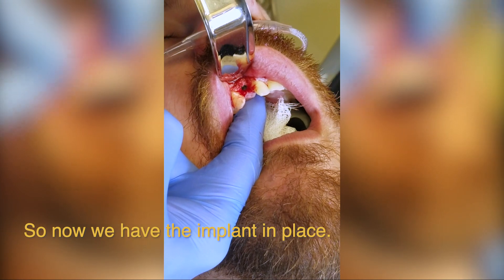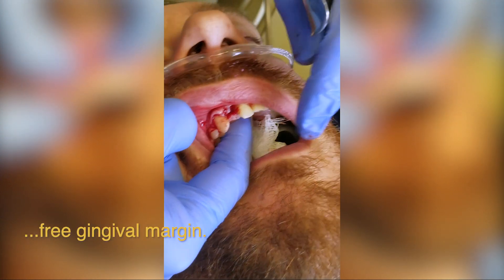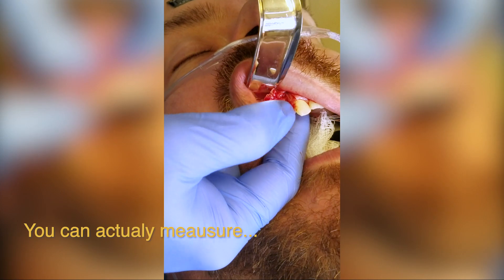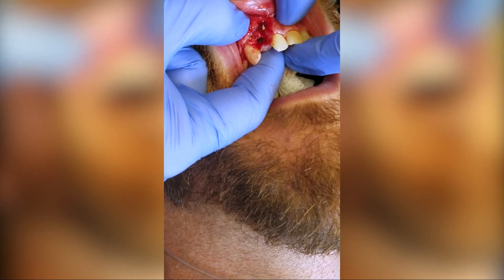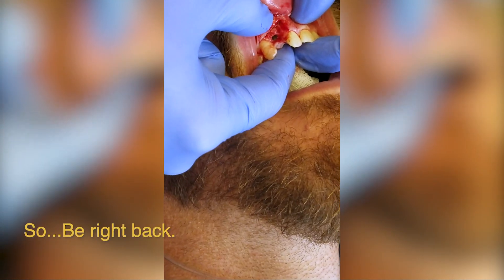Excellent. Now we have the implant in place. You want it 2.5 to 3 millimeters below the proposed free gingival margin. Take a look over here — it gives you an idea of tissue height. You can actually measure across like this, and when I measure that distance, it's about two and a half to three millimeters. So that's where we want it. Next, we're going to take a fixture level impression of where it sits.